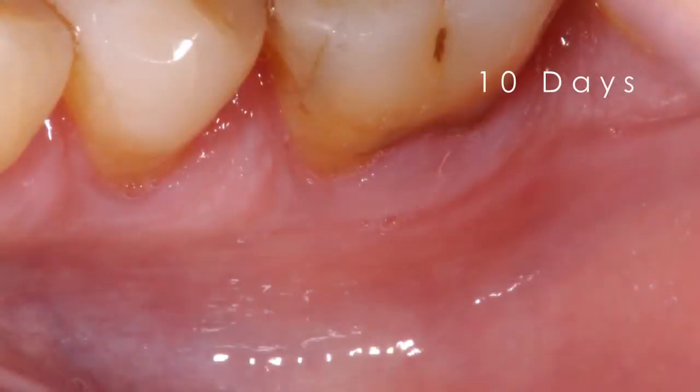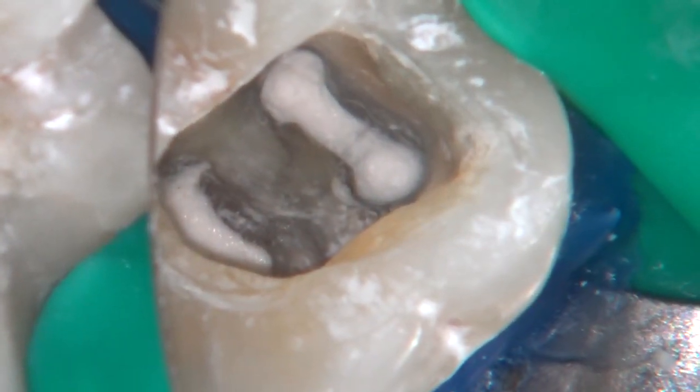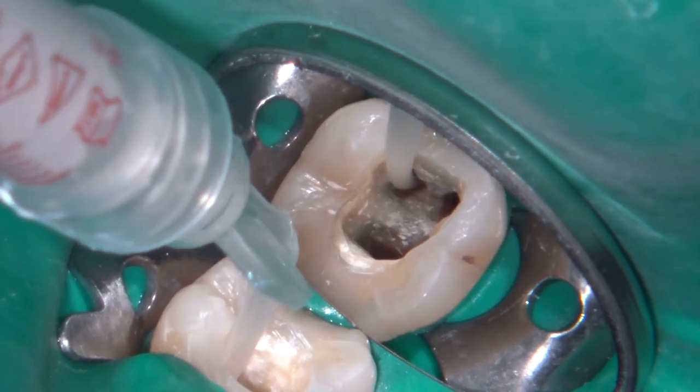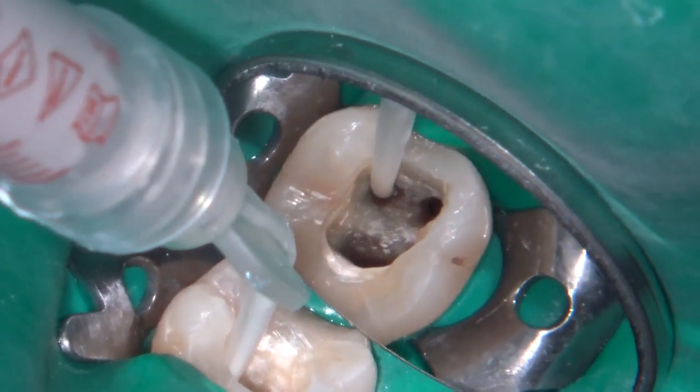Calcium hydroxide medication was placed. After 10 days, the tooth is asymptomatic. Calcium hydroxide is removed and the canal filled with pre-mixed calcium silicate cements and single cones.